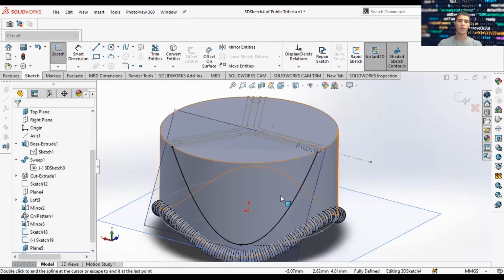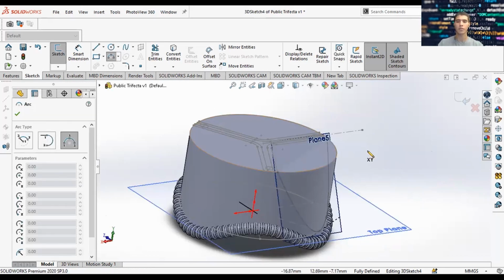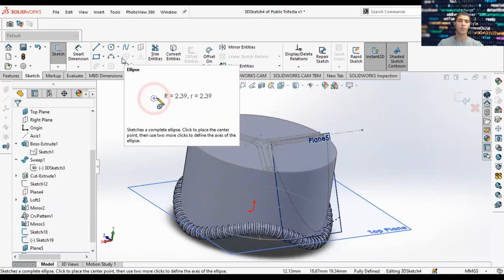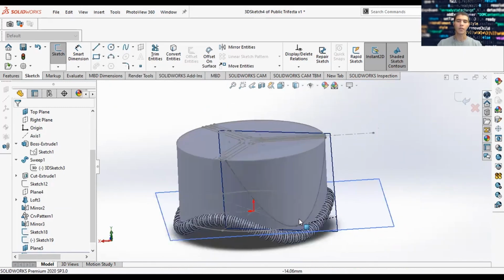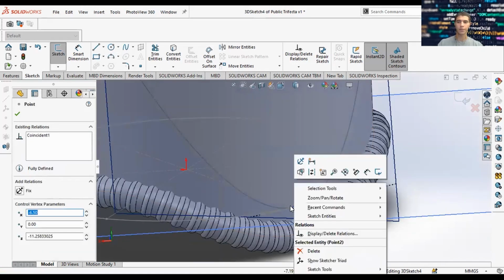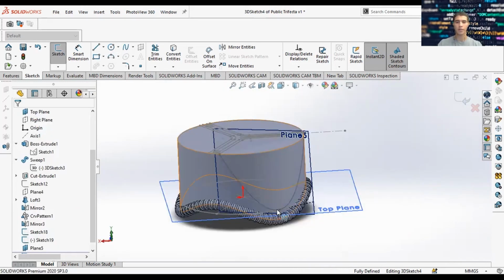And you'll notice, instead of an arc, it does a spline. Particularly, splines are powerful because they're not defined by a certain geometry. If you want to have an arc, then the arc will have constraints related to arcs. Same thing with ellipses. They have a set geometric shape, geometric constraints. Same thing with 3-point arc slot, or hyperbolas or parabolas. But a spline can be whatever you want. The only inputs that you need to consider in a spline are the spline curvature and the direction.